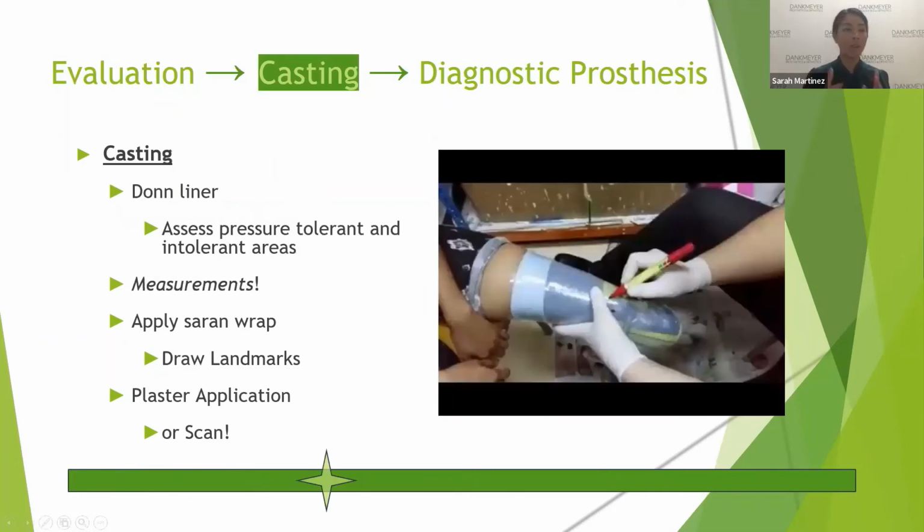Okay, casting. I'm crossing my fingers that this video plays. Angie, I'm not sure if you're able to see the time on the bottom of the video once it does play. But what this video is showing is the casting process, which is pretty fun for the most part. What is involved is that the patient dons the liner, and typically there's a gel liner, whether it be silicone or urethane or TPE, just different types of gel consistencies and materials on the inside of the liner. And then there's that fabric outside.